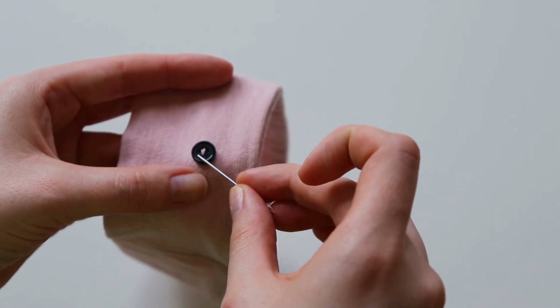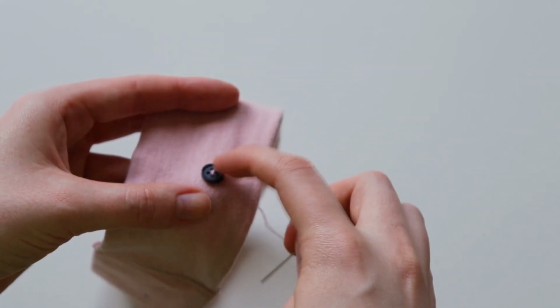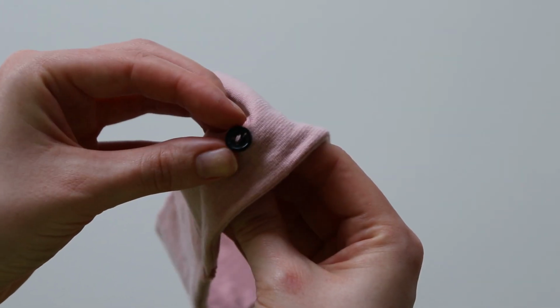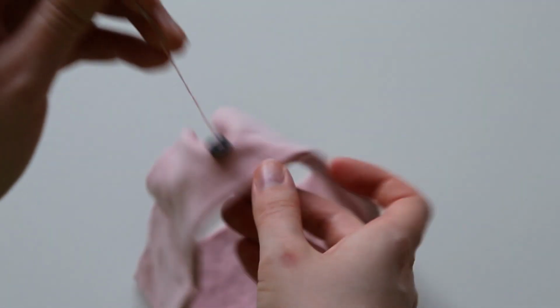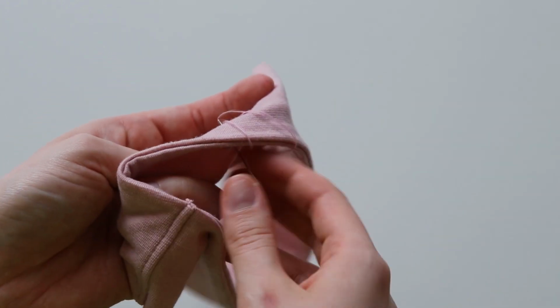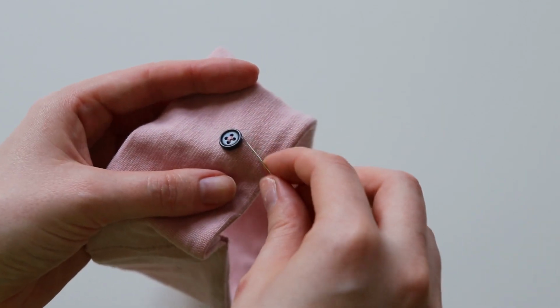So for those of you that need a basic sewing lesson, I did come out this way, and you are going back under on the opposite side. Now that I've done that once more, I am going to again come down here. Don't prick yourself, kids. Again, do not give your nurses another job. You can see we are coming through a different hole now, pulling this up, pushing it over to the opposite one, and then just back under this other side. So just go ahead and repeat this a few times until you feel like this is properly secure.